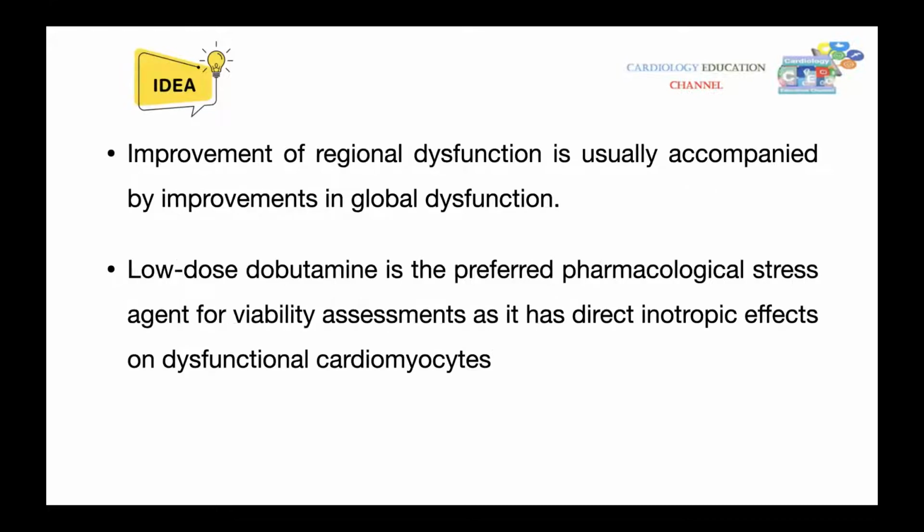And the improvement of the regional dysfunction is usually accompanied by improvement of the global dysfunction. The global LV function is improved in the particular segment itself. And this is very important to see by the dobutamine stress echocardiography. And this is one of the most powerful points in this modality, as we will talk later about this.